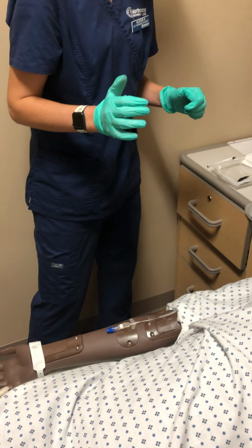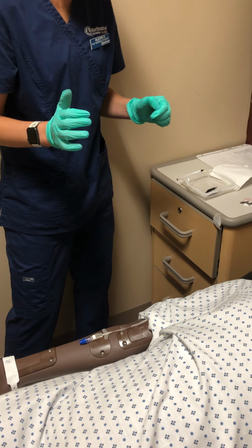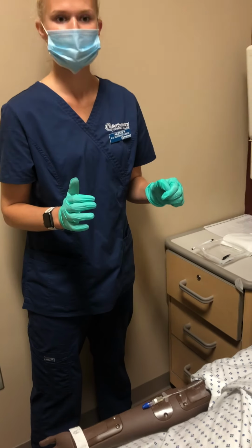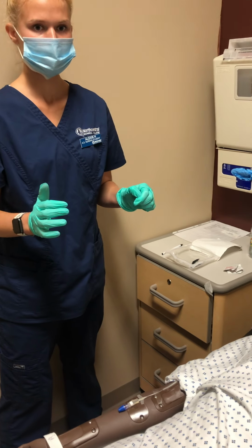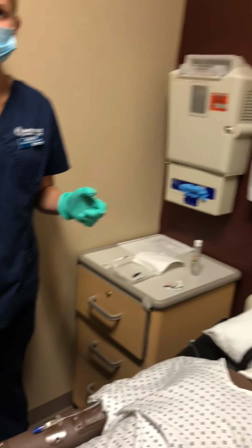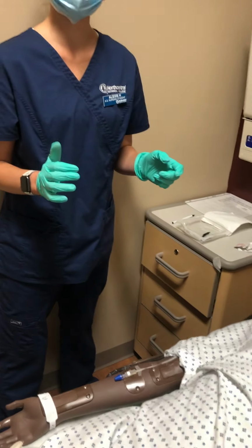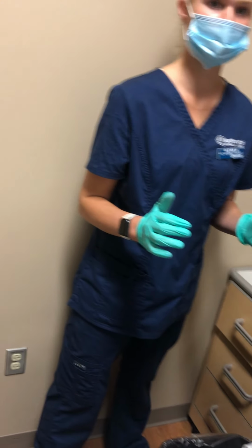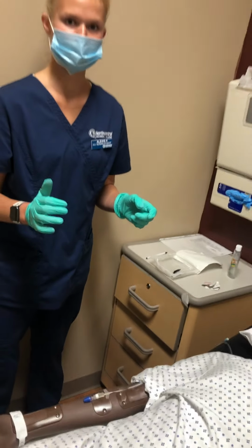And then next, could you please hand me the dressing and then open it up for me? There should be another one at the bottom of the pile.